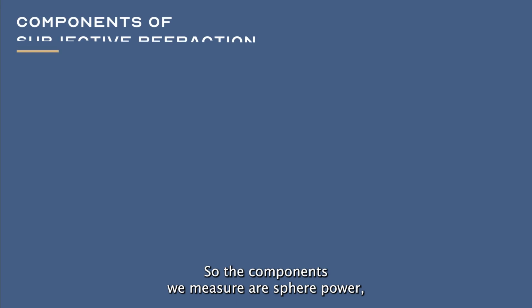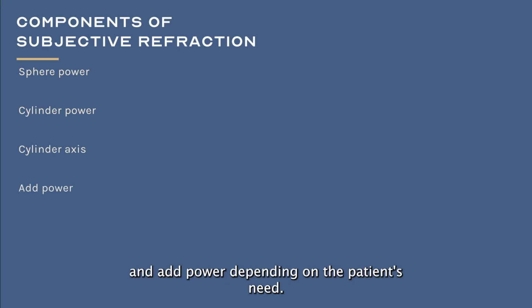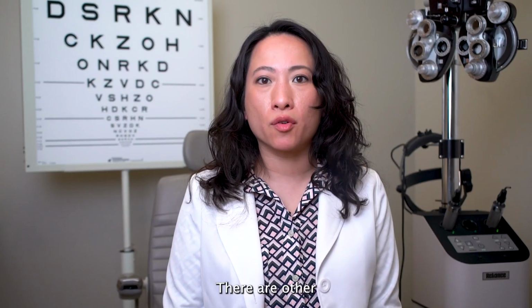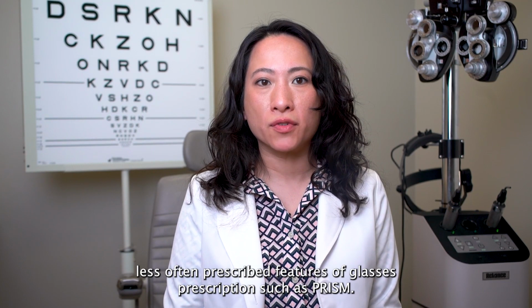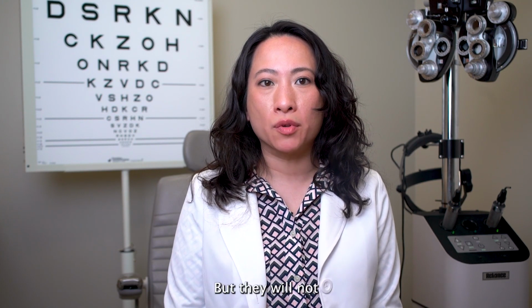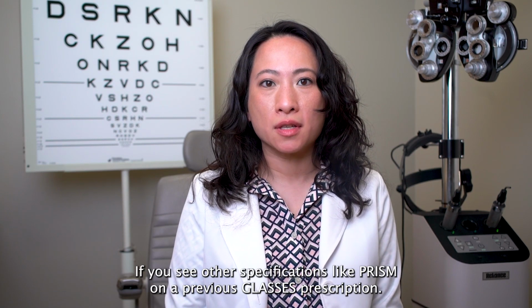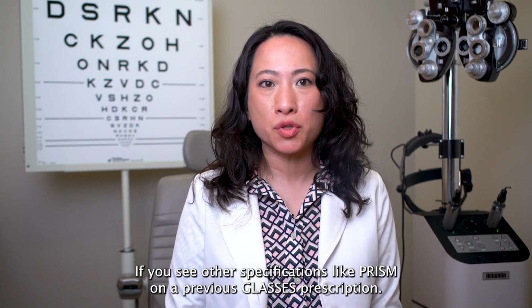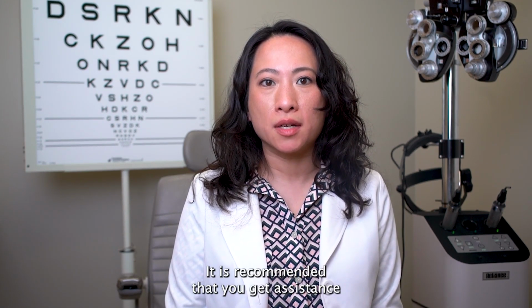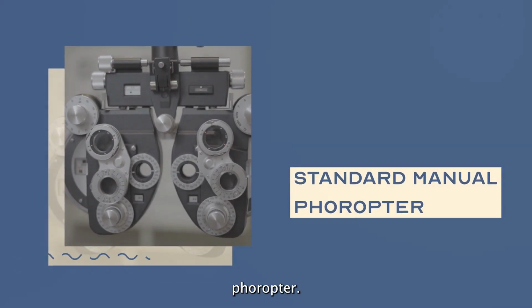So the components we measure are sphere power, cylinder, axis, and add power, depending on the patient's need. There are other less often prescribed features of glasses prescription, such as prism. These specifications are critical to the glasses prescription, but they will not be explained in this session. If you see other specifications, like prism on a previous glasses prescription, it is recommended that you get assistance from your doctor. Now we will look at a standard manual phoropter.